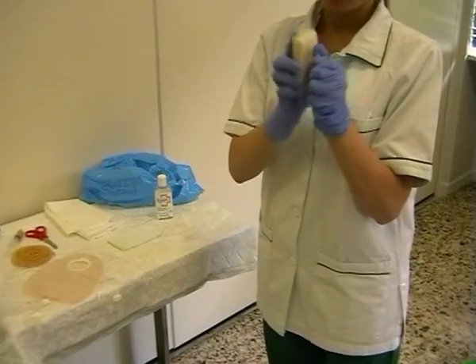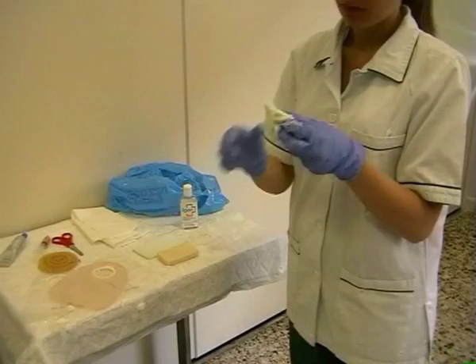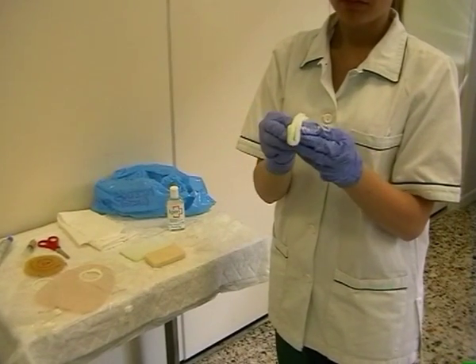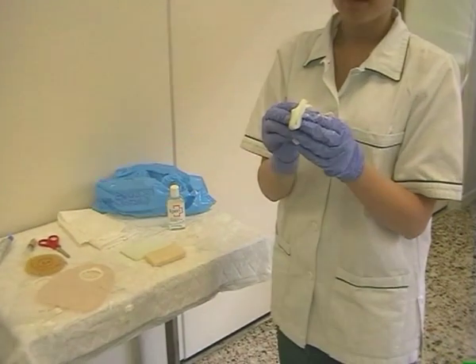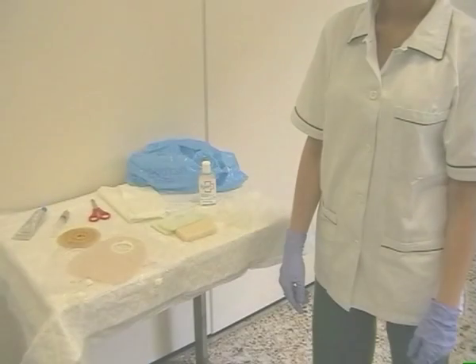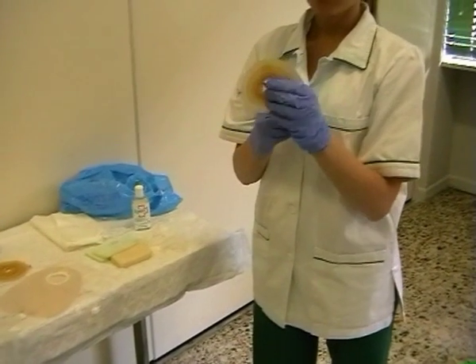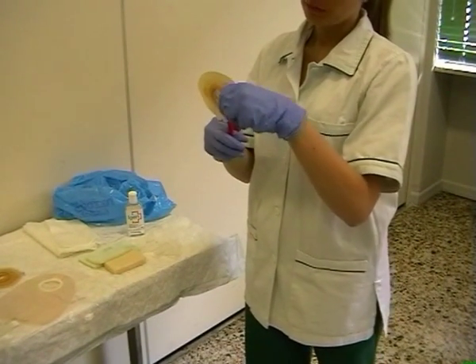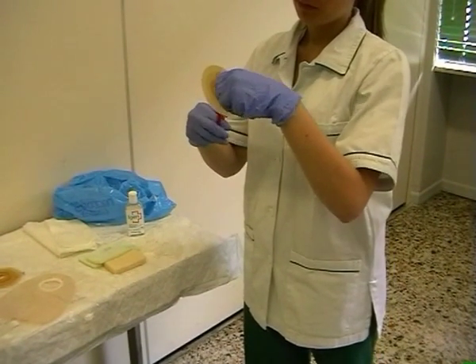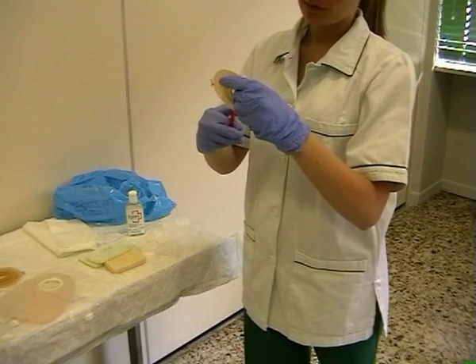È bene insaponare bene la spugnetta prima di detergere lo stoma. È importante tagliare la placca con le forbici dalla punta arrotondata e seguire la misura giusta dello stoma.